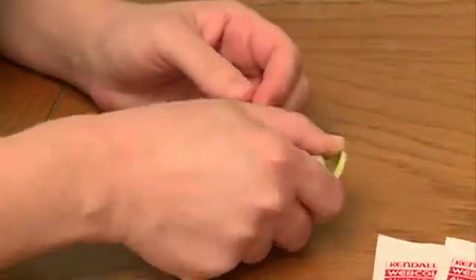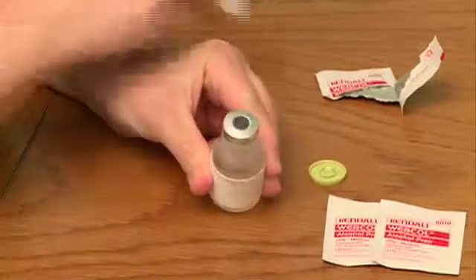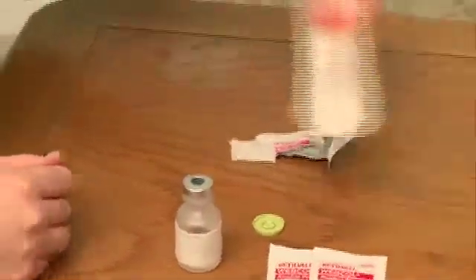Flip off or remove the cap on the medication vial. Swab the top of the vial with an alcohol swab. Do not touch the top of the vial once it has been cleaned with the alcohol swab.